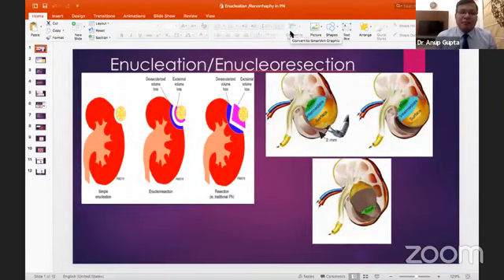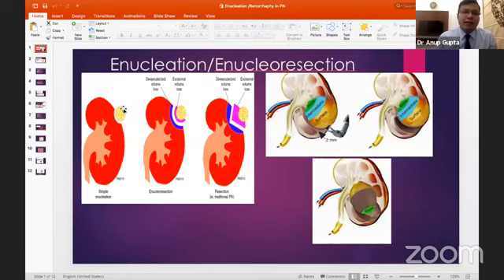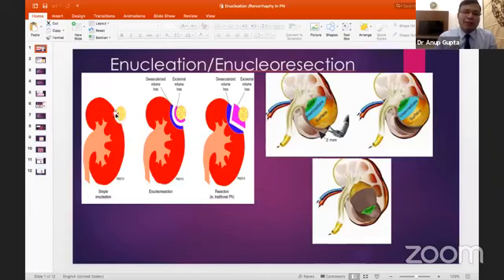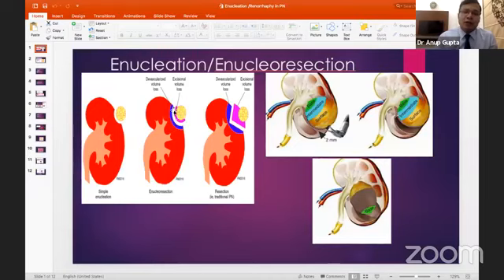The basic difference between enucleation and enucleoresection is that in enucleation we do a blunt dissection, following the anatomical plane between the pseudocapsule of the tumor and the normal parenchyma. In enucleoresection, we take a small rim of parenchyma along with the tumor. The problem with enucleoresection is that this rim of parenchyma will be devascularized when excised.